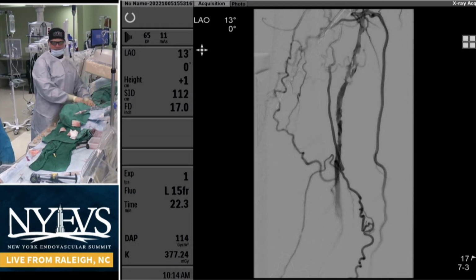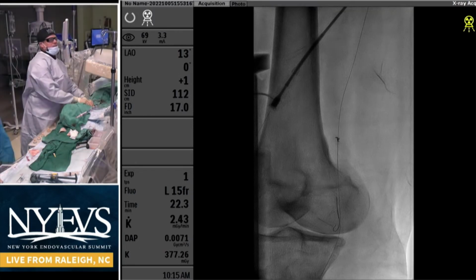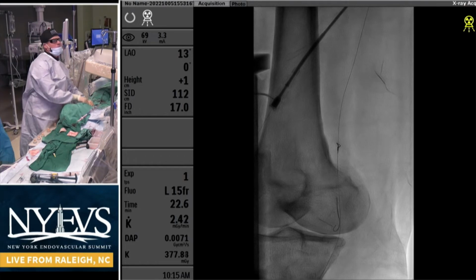So what I'm going to do is I'm going to take a Corsair from below. Yeah, that's one of the other techniques I can do, to see if your wire entangles there and you feel it touch, you're very close. And I think that's the right spot to re-enter or try to connect those two dots by either re-entry, tearing those intima off, and trying to connect those wires.